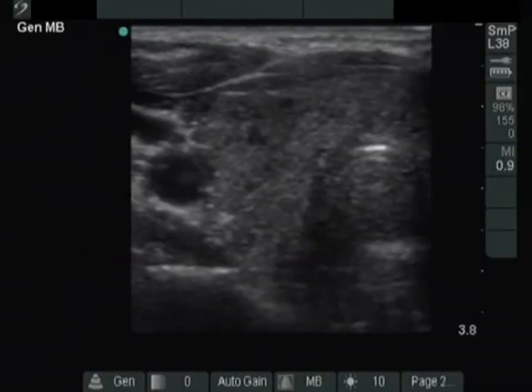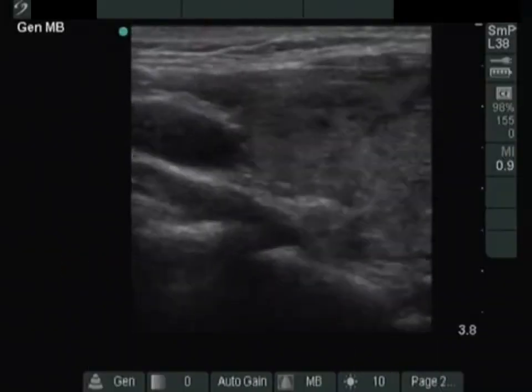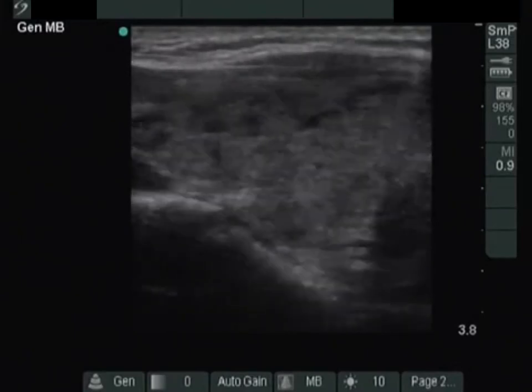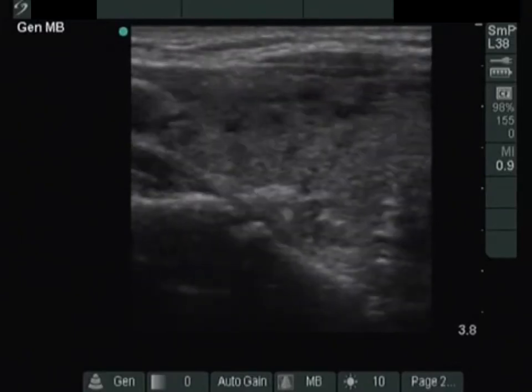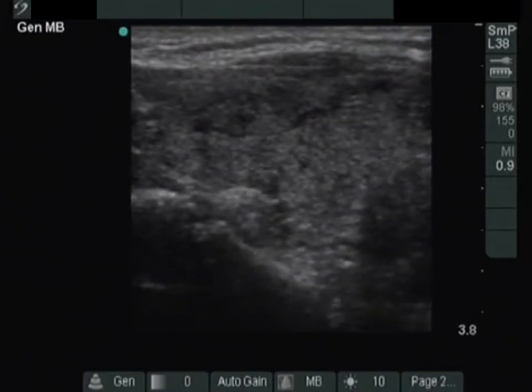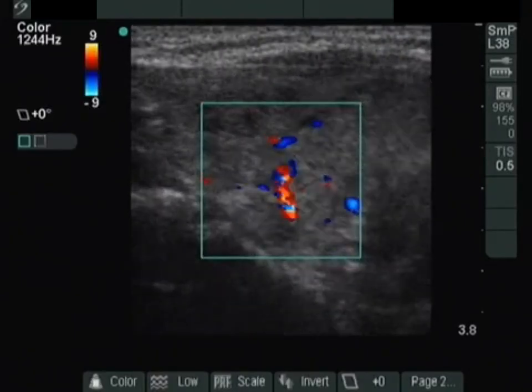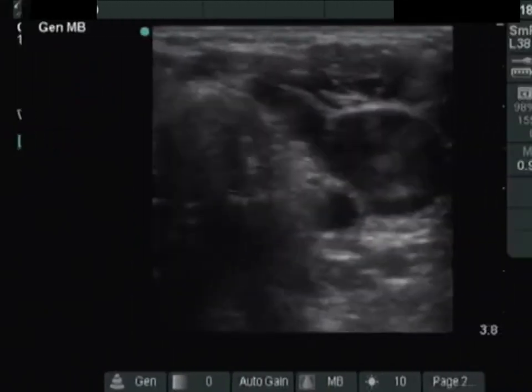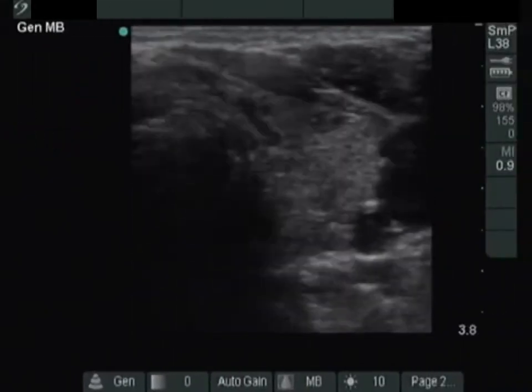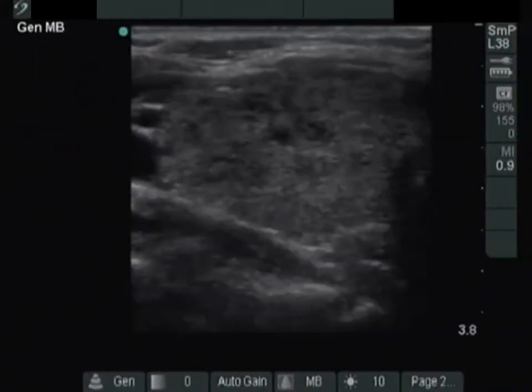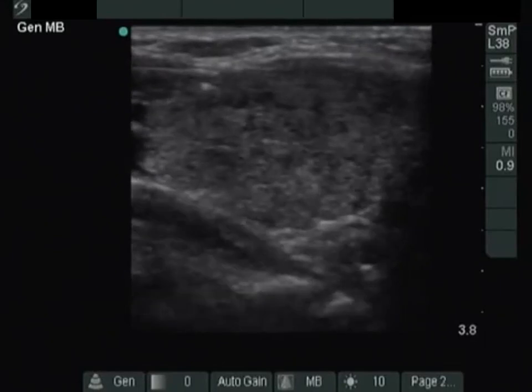The right lobe is echinormal and contains hypoechoic areas. The echogenicity index is around 15%. The left lobe has a similar appearance. This pattern corresponds to Hashimoto's thyroiditis.